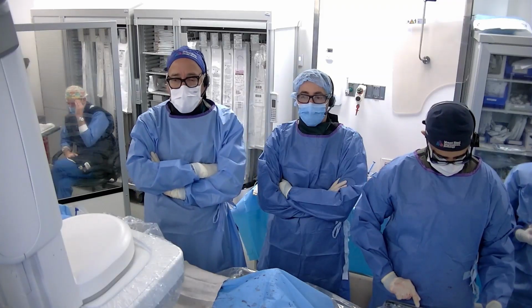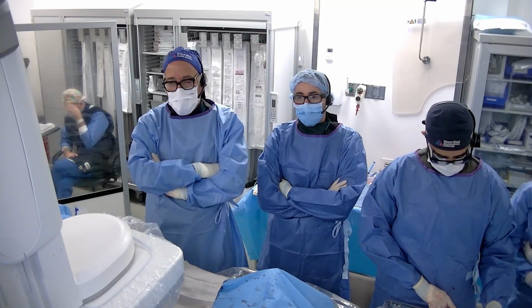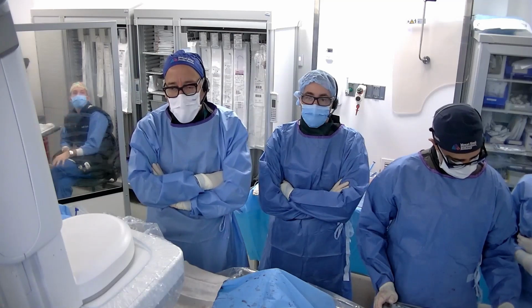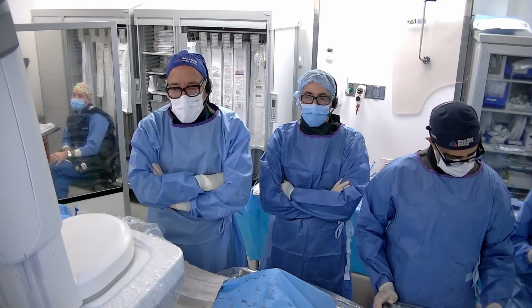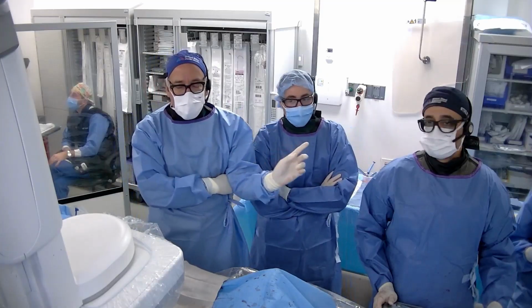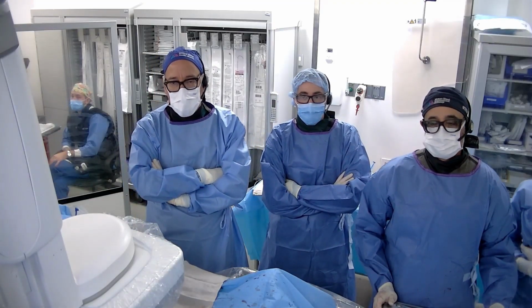This is mild to moderate calcium. This is not an ESRD patient, so I'm not trying to make it out like that. This is more, I think, severe atherosclerosis with a mild to moderate amount of calcium. And I have intravascular imaging to show you that will confirm that in just a moment. I'm going to let my colleague Rahul Patel go through the images of what was done before we went on camera.